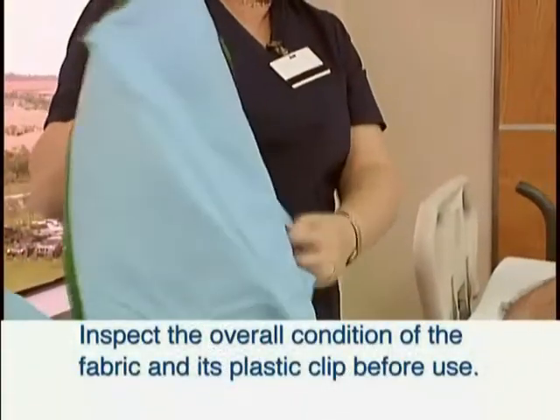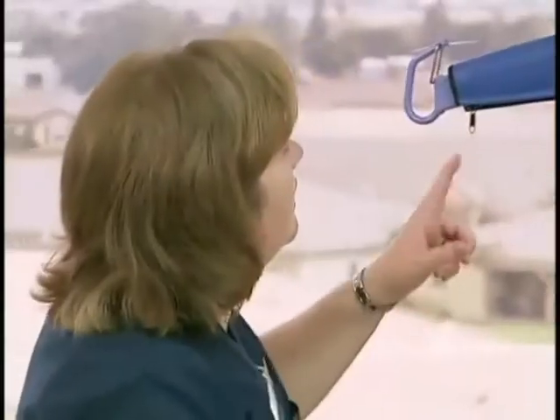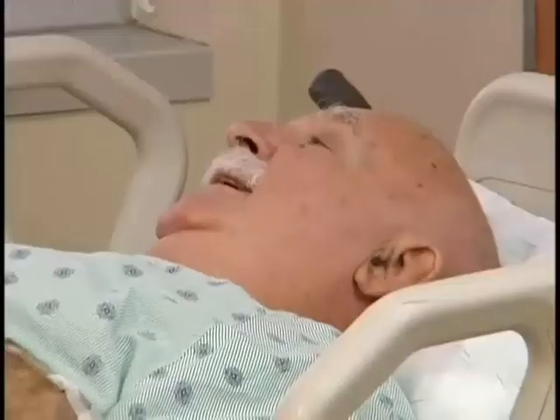Inspect the overall condition of the fabric and the plastic clip before use. The caregiver should always tell the patient what they are going to do.